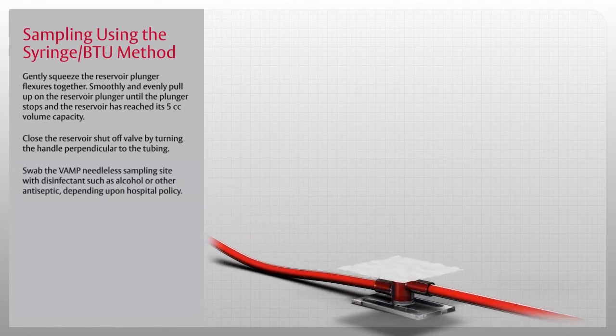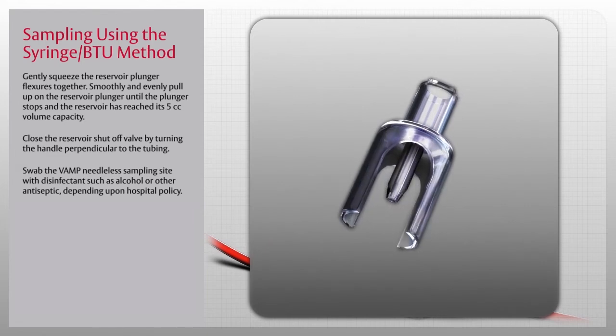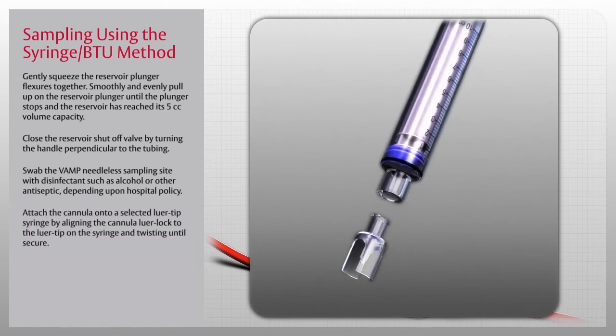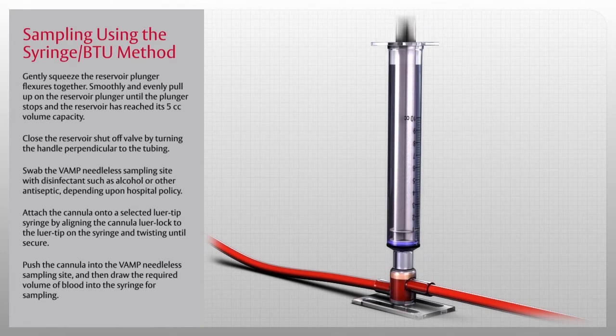Swab the VAMP needleless sampling site with disinfectant such as alcohol or other antiseptic depending upon hospital policy. Obtain an individually packaged VAMP needleless cannula and luer-tip syringe. Using aseptic technique, peel open the cannula pouch, pick up the cannula by the protective shield, and attach the cannula onto a selected luer-tip syringe by aligning the cannula luer-lock to the luer tip on the syringe and twisting until secure. Ensure the syringe plunger is depressed to the bottom of the barrel, push the cannula into the VAMP needleless sampling site, and draw the required volume of blood into the syringe. Do not use a hypodermic needle through the sampling site. To remove the syringe-cannula assembly, grasp the cannula and pull it straight out.